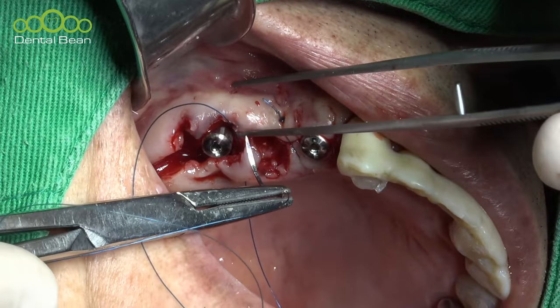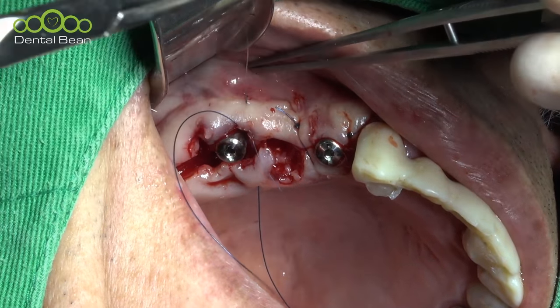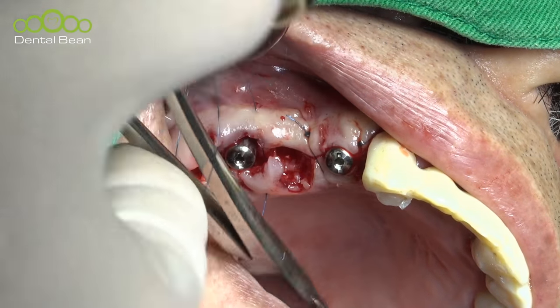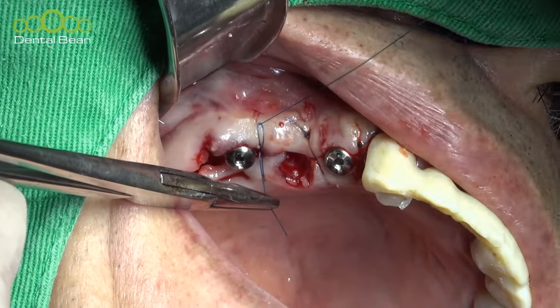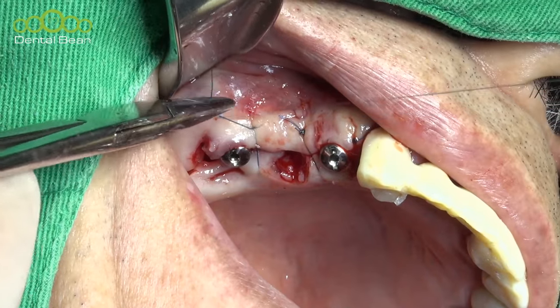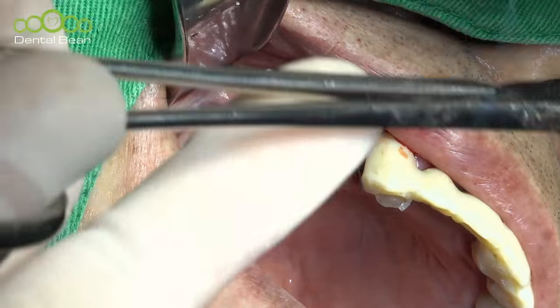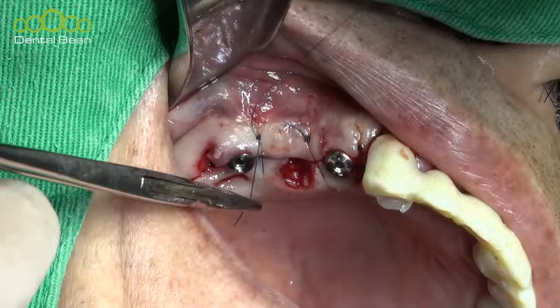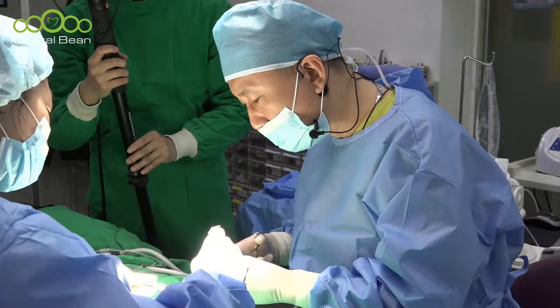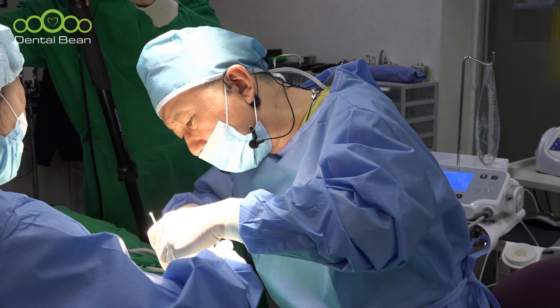As I noted before, the first line patient is not difficult. So this is the very conventional immediate placement. The second implant, the gap distance is very small, so no bone filler or membrane is required, just flap closure is okay. At this time, healing cap is very important.